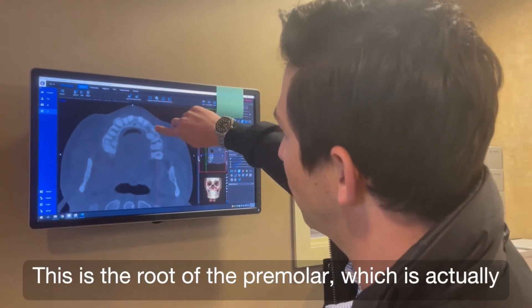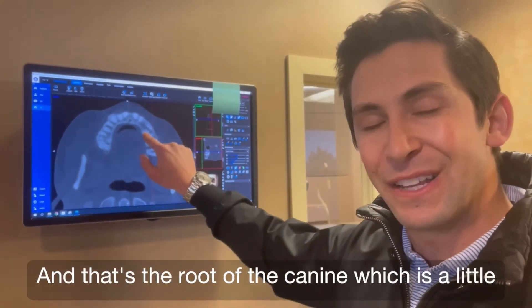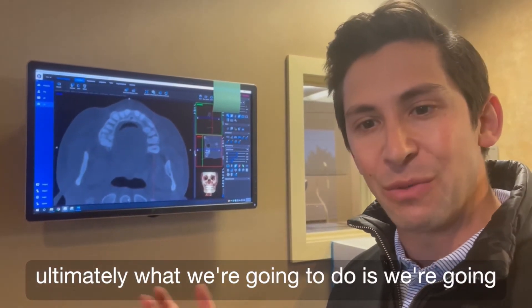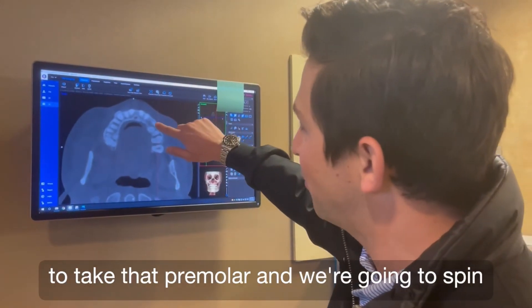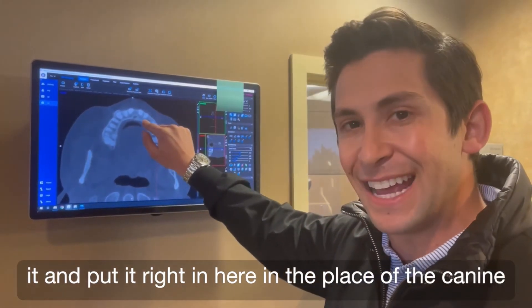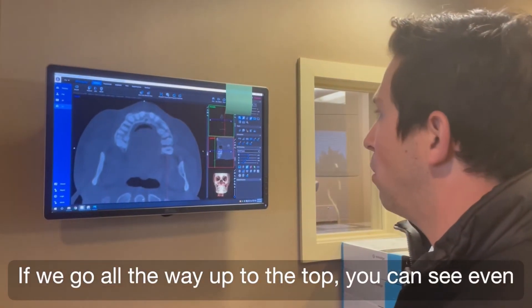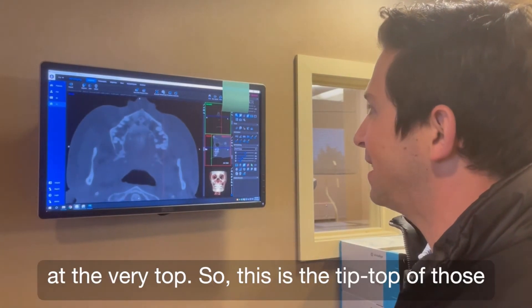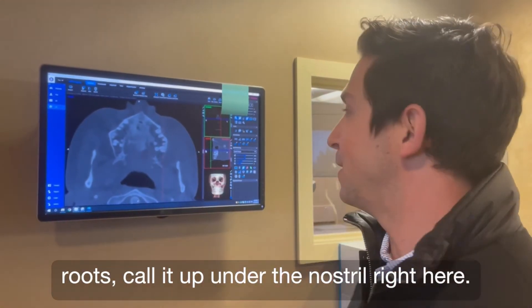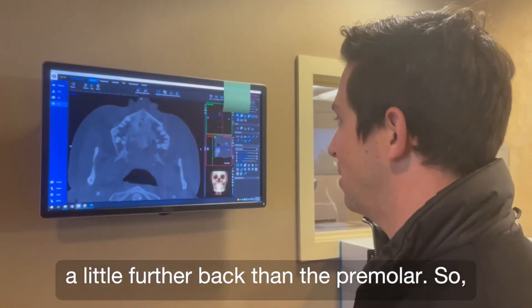This is the root of the premolar, which is actually a little bit closer to the front of the mouth, and that's the root of the canine, which is a little bit closer to the back. So this helps us decide what we're going to do — we're going to take that premolar, spin it, and put it right here in the place of the canine, and then take the canine and slide it over. Going all the way up to the top, you can see even at the very tip top of those roots, up under the nostril — that's the very tip of the canine, so it's even a little further back than the premolar.